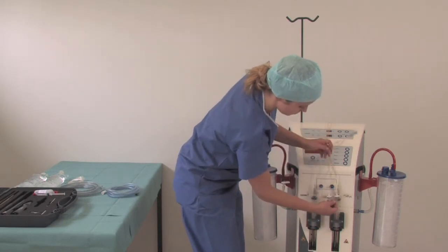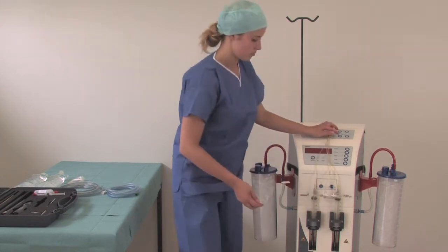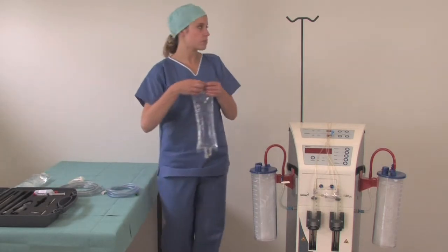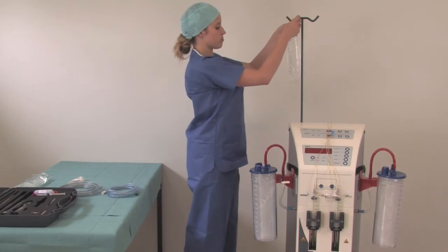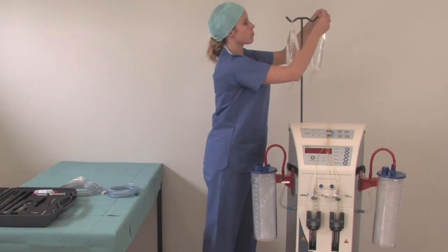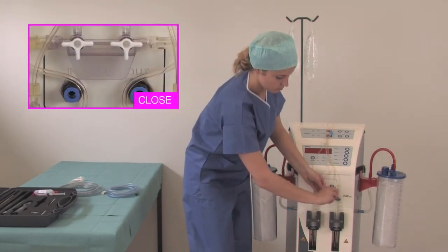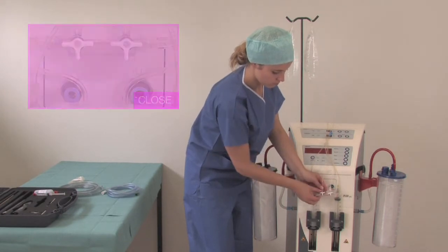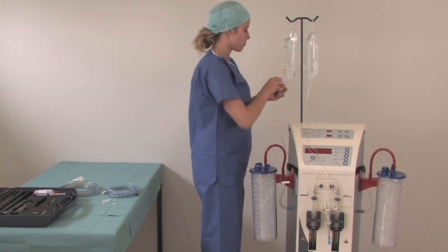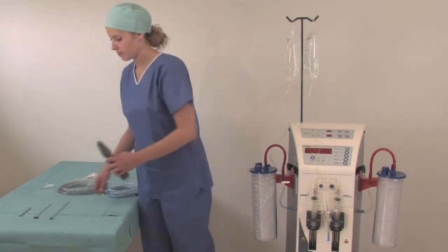Check that the 3-way stopcock manifold is accessible. Tubing must be clear and pointing up. Place the tumescent solution bags on the infusion stand. Close the infiltration stopcocks. Spike tumescent solution bags. Connect the tubing to the tumescent solution bags.